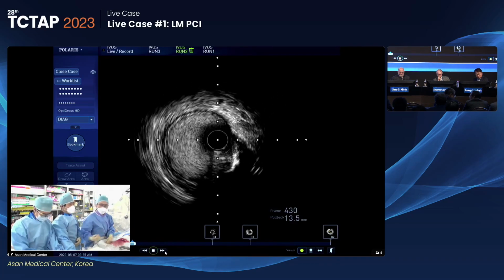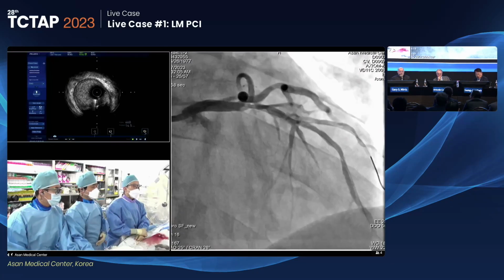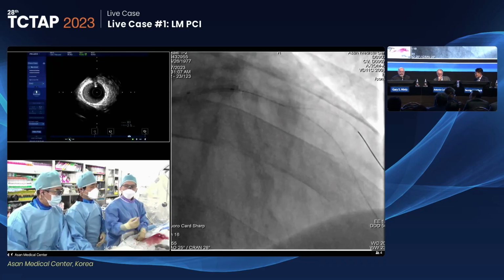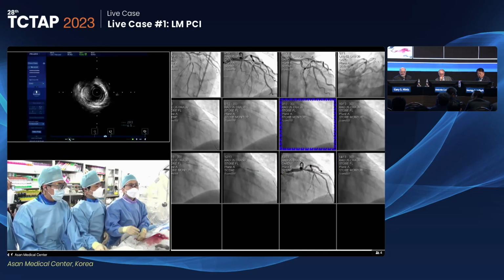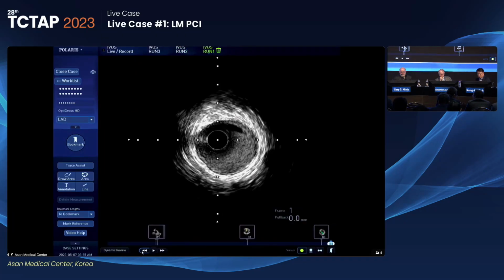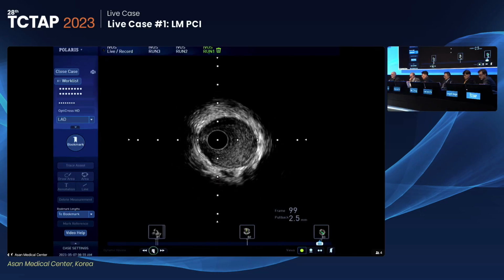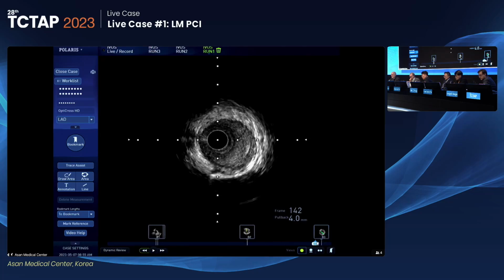And can you please show the angio again? Could you just show the very beginning of the LAD IVUS? Just the very beginning. I want to point something out to the audience. First run, IVUS first LAD run. Can you please show? First IVUS, LAD IVUS at the very beginning. Yes, thank you. Okay, now stop right there. Stop and go back. More distal. Go back, more, distal.